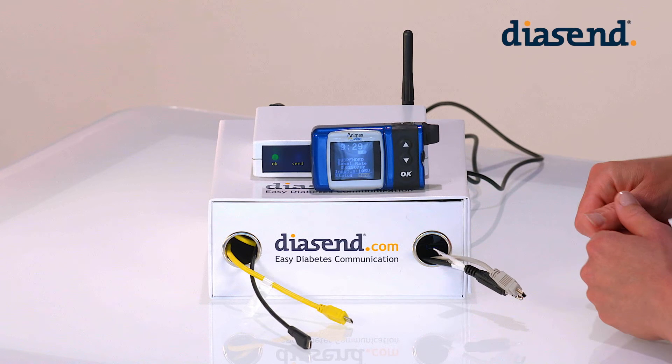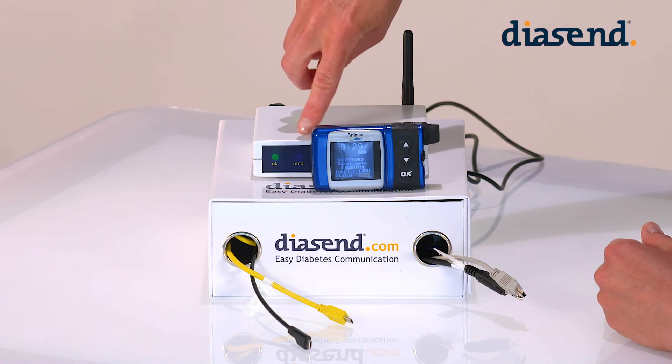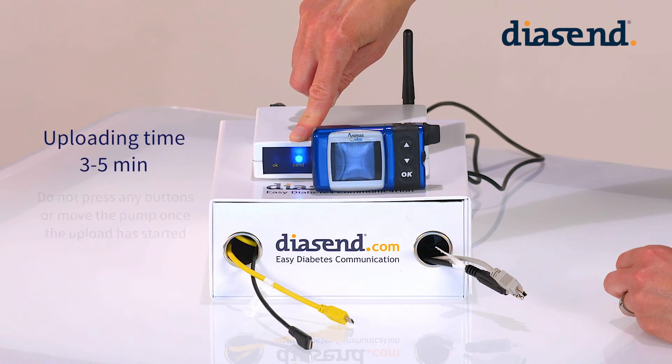You need to make sure that the pump screen is illuminated when the transmission begins. Once we have placed the device, you can see that the blue light will change from flashing intermittently to flashing quickly. This means the device is uploading.